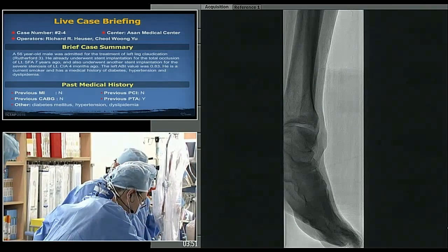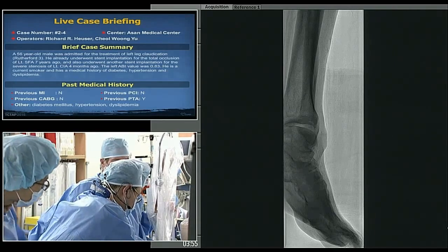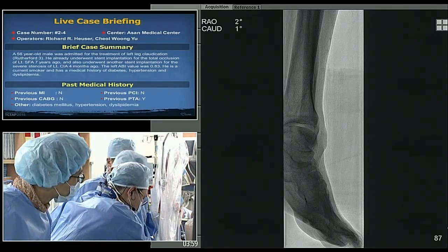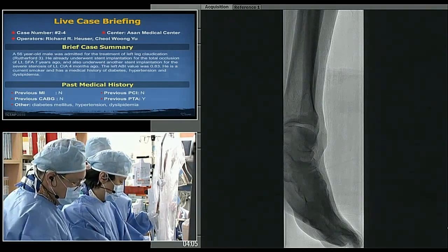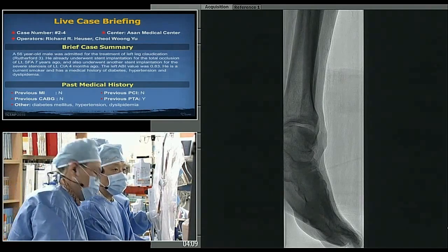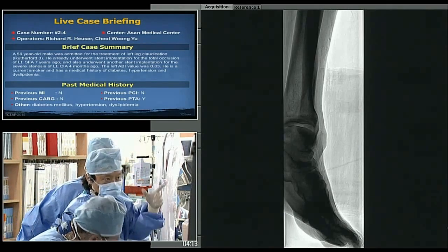Oh, let's see. Are we going to start a little higher, or are you just going to go here? A little bit higher.